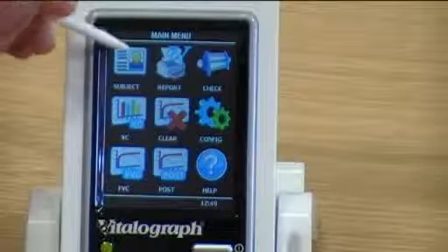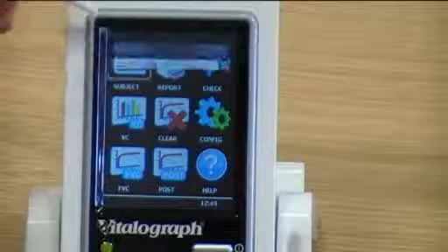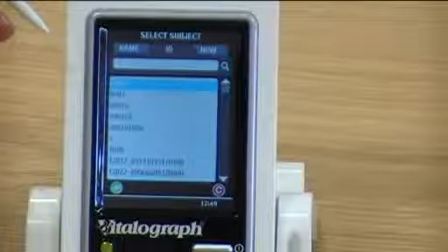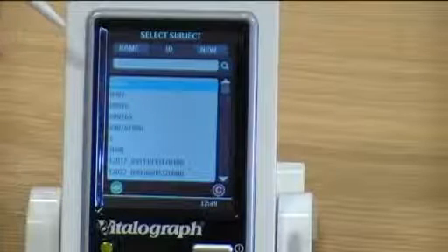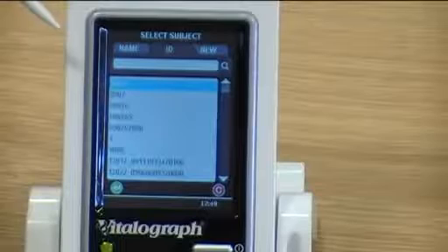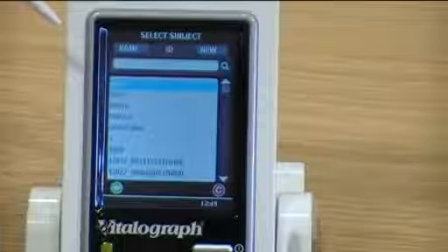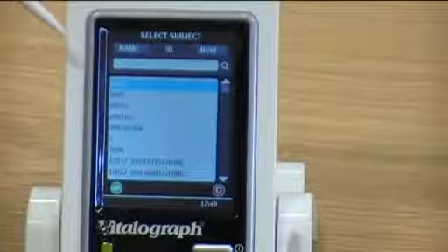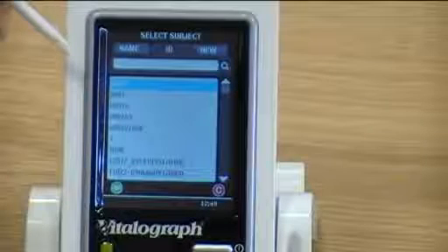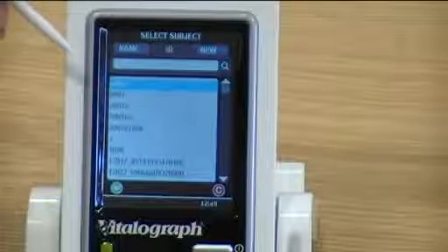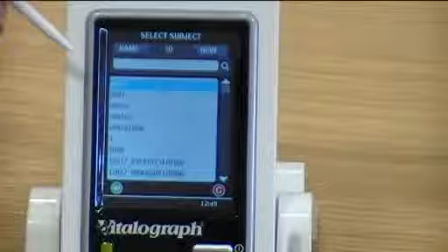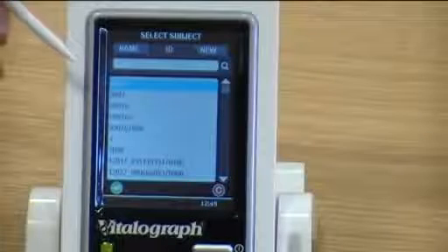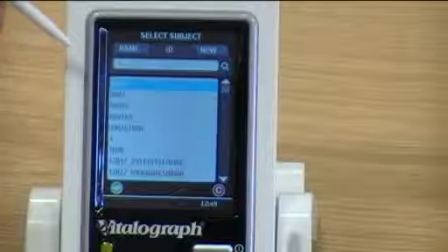Press the subject icon. You now have a select subject screen whereby you can recall a patient by name, ID, or as a new subject. If you are recalling a subject, the Intuitive will automatically store all the subject data and all the test sessions on the Spirotract database, and updates both the device and the database with any new subjects.